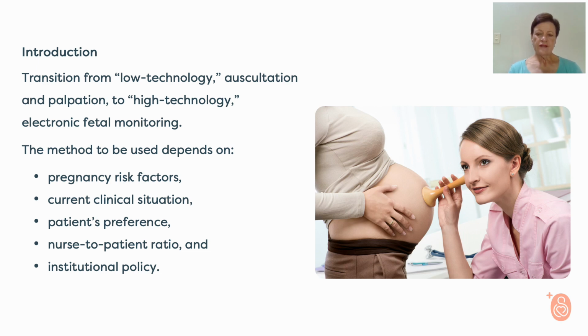Gradually over the past years, we had a transition from the low technology auscultation, like you can see here in the photo with an ordinary fetoscope, to the high technology of electronic fetal monitoring. Every midwife who works in an antenatal ward and in the labor ward will use the CTG from time to time. That is why it is so absolutely important that all midwives should be able to know and interpret the CTG.